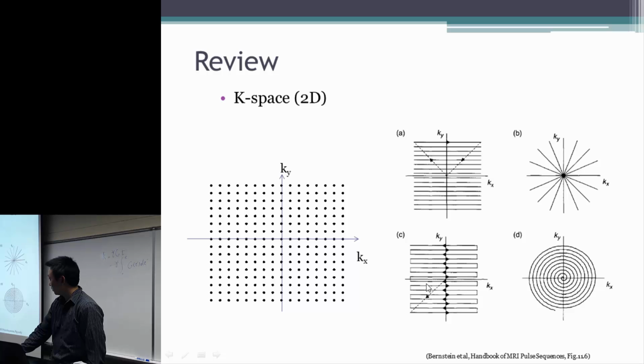And here, what we'll be seeing is the K-space filling scheme for EPI. We can also have some of the other K-space collection schemes. Like this is the radial. We just collect a series of readouts, but in radial. So here there is no concept of phase encoding, it's just a series of rotating readouts. They are all readouts in here.